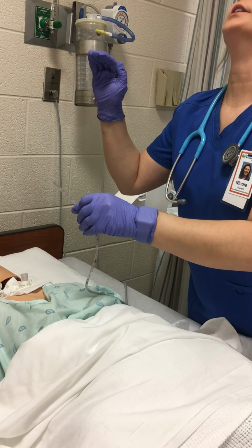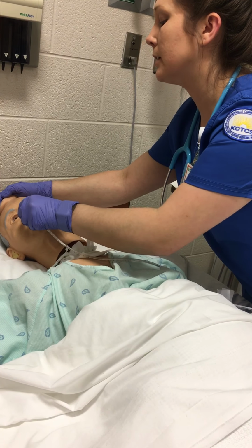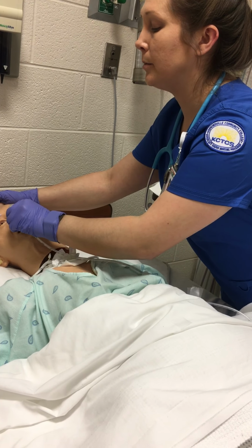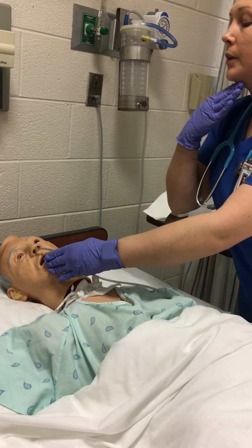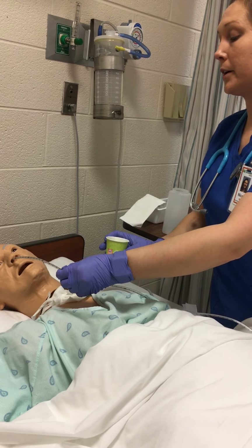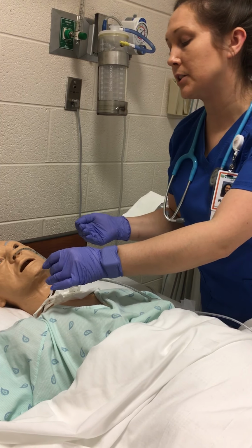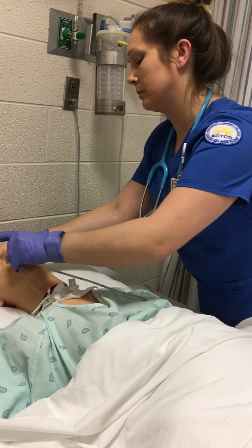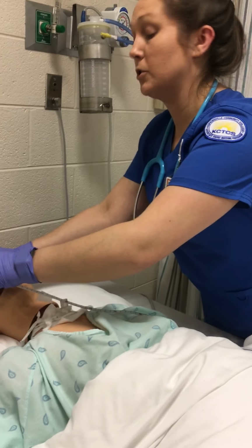I'm going to ask the patient to tilt their head backwards, and I'm going to start administering the tubing and ask the patient to let me know whenever it hits the back of their throat. When it does, I'm going to have them move their head forward, chin to the chest, and at that time I'm also going to give them some water, preferably ice cold water to help give a numbing sensation, and as he's swallowing, I'm going to administer the rest of the tubing. Okay, this tubing doesn't go all the way in.